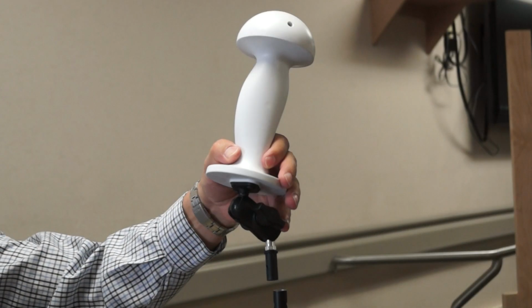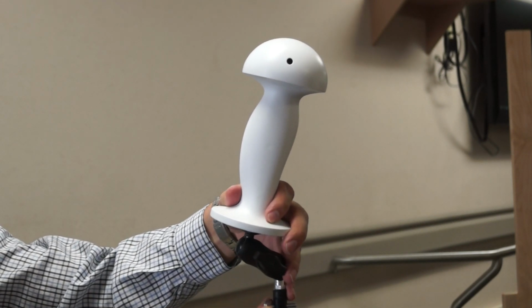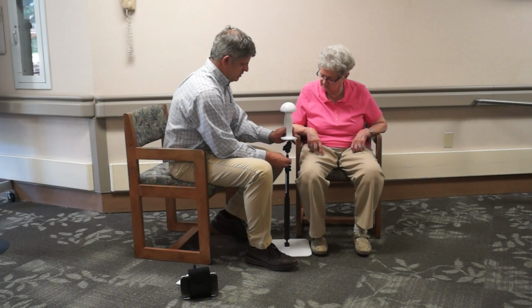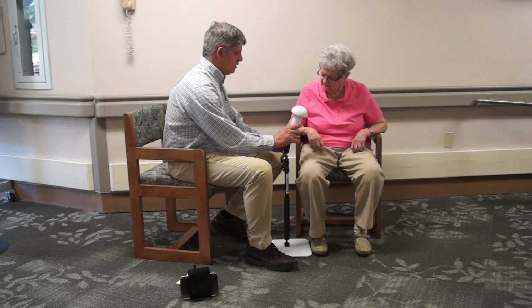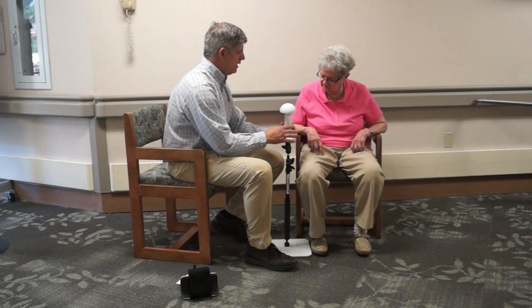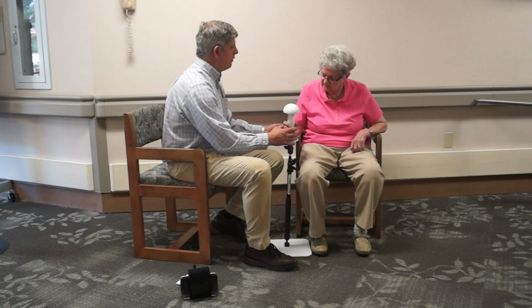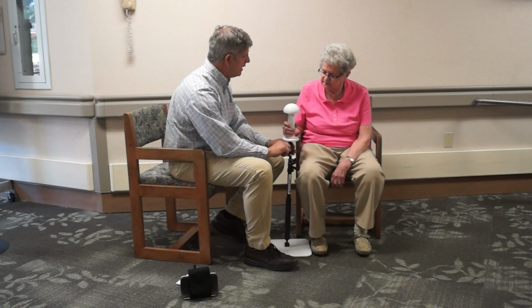When you do this at home, you can interchange this. So I'm going to bring that down a little bit lower, and then I'm going to turn it at an angle for you, just to accommodate a natural position for you first. We'll go with this side. So let me have you place your hand around there, just lightly, and that way you're acting like you're holding something and sustaining that as you reach.